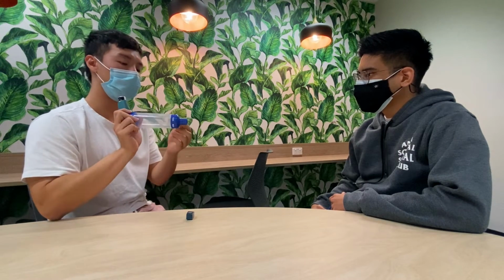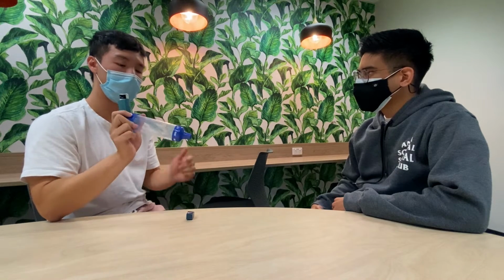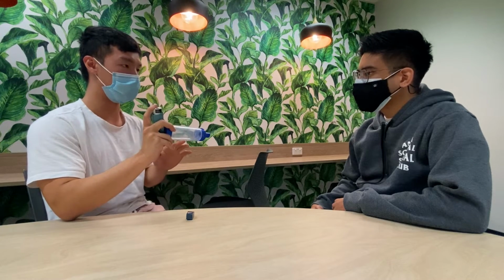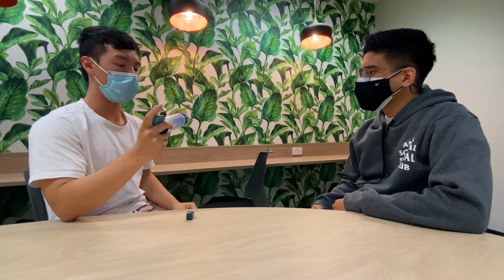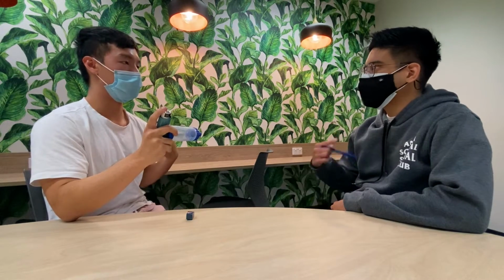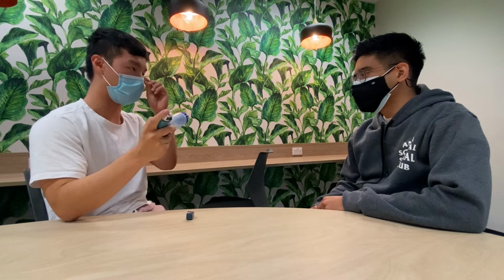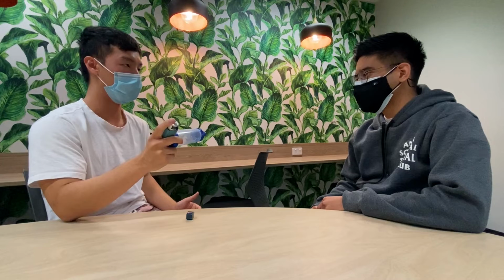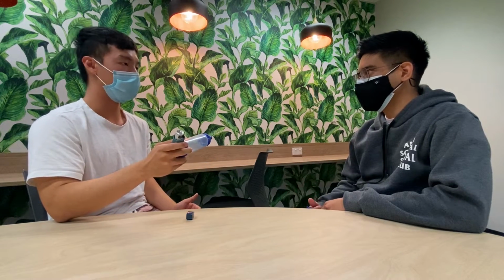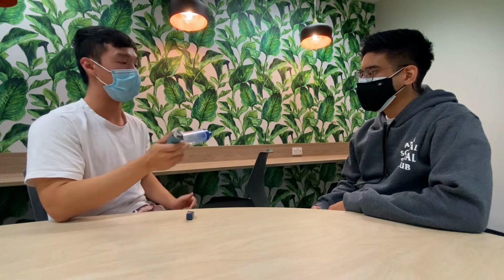It's the same deal. We want to get a firm grip with our lips around the mouthpiece on this end, and we'll offer maybe 1 to 2 sprays within the spacer itself. Once you have your mouth around the mouthpiece, just breathe in normally 4 times, a normal in and out tidal breath. After that, you can just relax and breathe normally. Does that make sense? Yep, so breathe in and out normally 4 times. Yes. And then you can take it out. Okay, exactly. So that's the technique for both a preventer and a reliever.